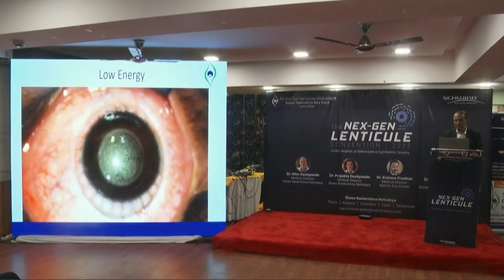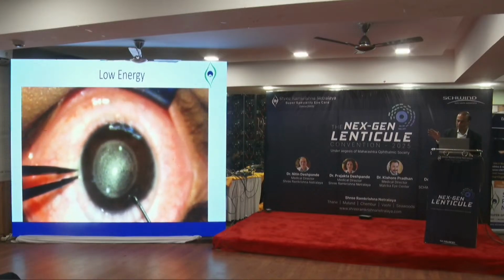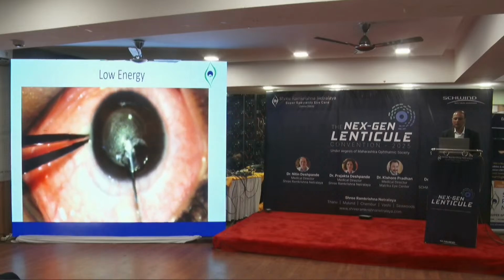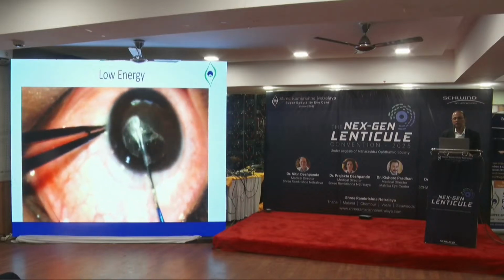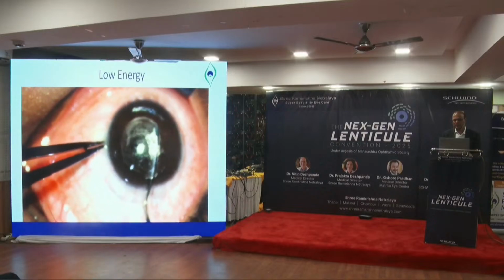Secondly, in this case we saw that there was no bubble formation, again an energy issue. But my application specialist said, sir, doctor, it's cut, you go ahead. Although you can see I was not very sure whether I should proceed, he was very confident that the cut was made. So I went ahead, but it was difficult, again because of the energy setting issue. This was happening for the first one or two sessions, and this is probably a second session video.